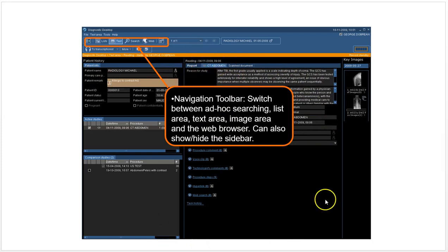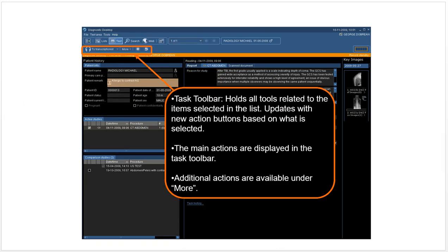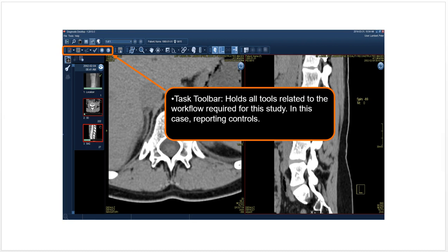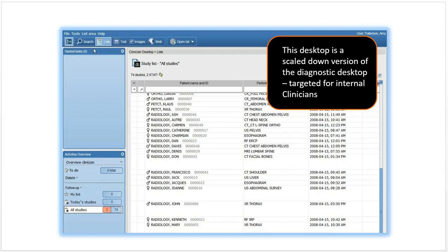If you look back here, you have the navigation toolbar with the list area up, so you have the report here, the patient information in the report section, which is here. It's the same toolbar—it just appears with both the images and the list section. The task toolbar holds all the tools related to the workflow required for this study, reporting, things like that.